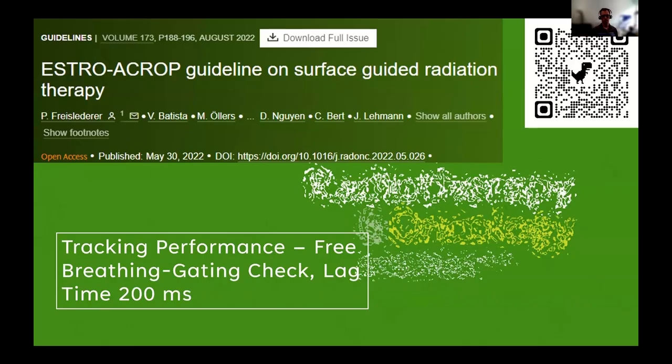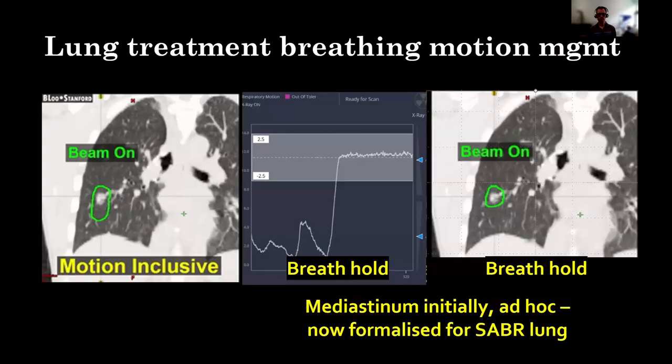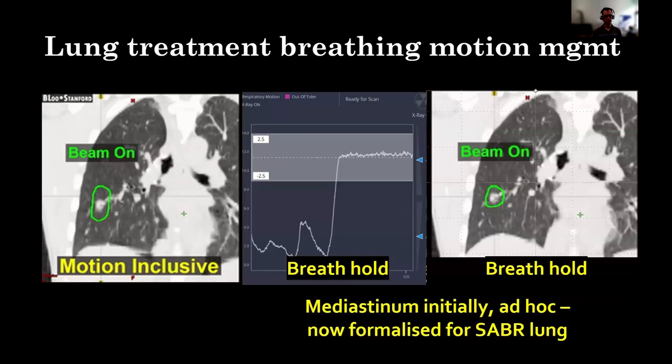So if you remember, a couple of the vendors were over that tolerance. Although I did hear recently that this 200 milliseconds is actually just the SGRT component, whereas my method measures it end to end. But still, they would likely be over that tolerance, which is something to keep in mind when choosing a system.